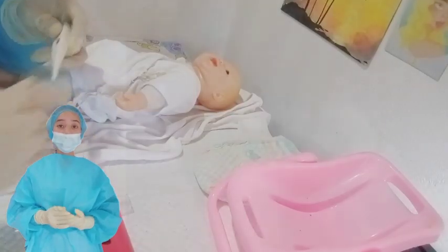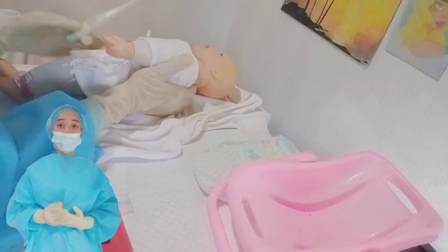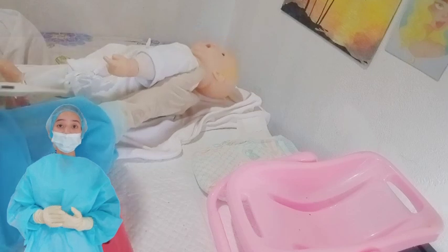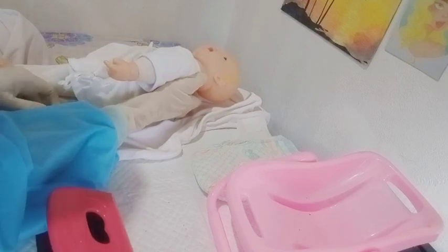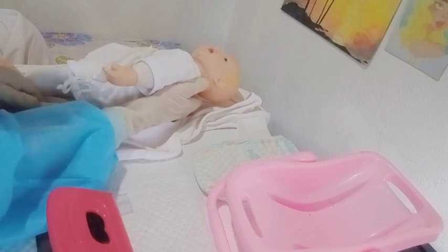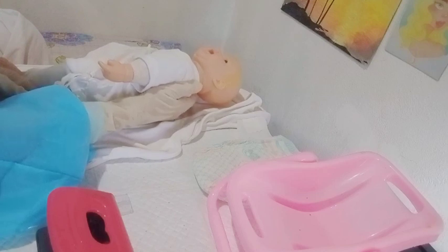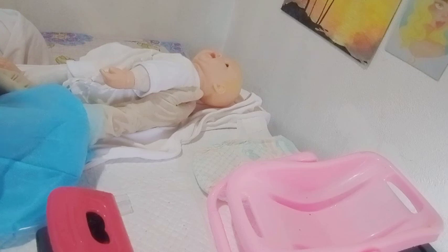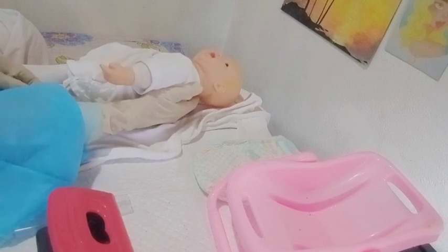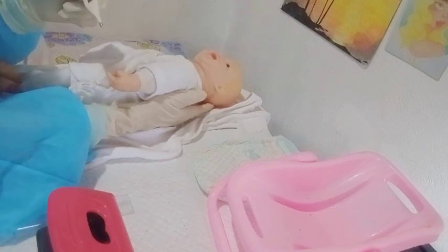Take rectal temperature for 1 full minute. Repeat taking temperature after 5 minutes if the neonate's temperature is below 36 degrees Celsius. If the baby has a low temperature, wrap the baby securely with a blanket. So the baby's temperature now is 36.6 degrees Celsius.